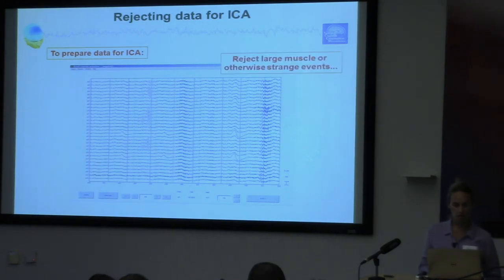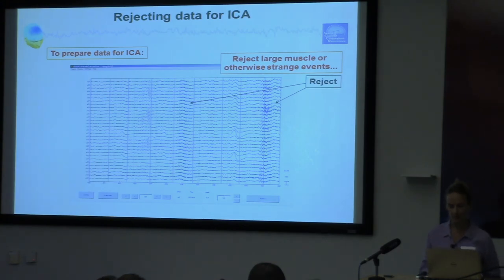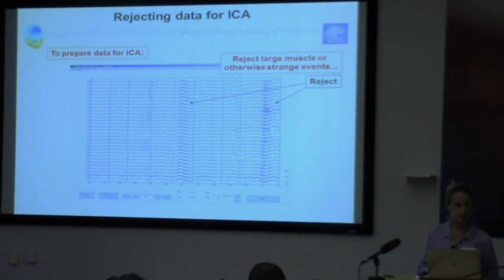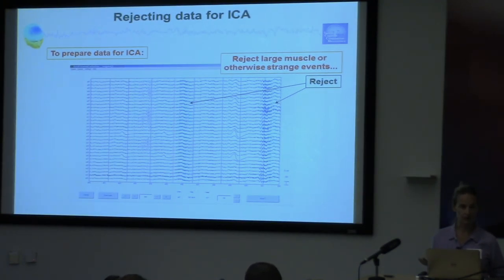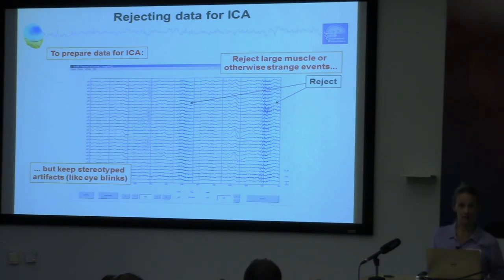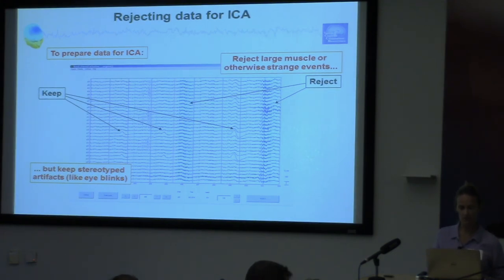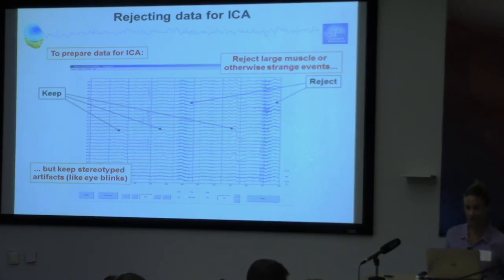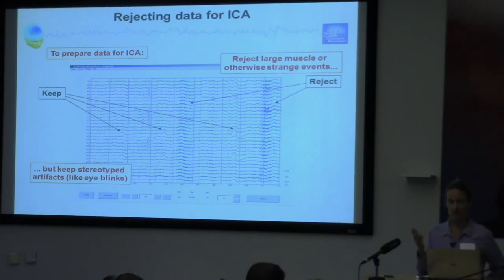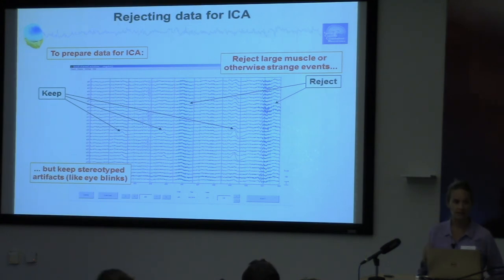Preparing for ICA: the general rule is that you want to reject large muscle or otherwise strange artifacts or events — things that are very large. However, you want to keep stereotyped artifacts like eye blinks, because ICA is very good at taking those out, and that's better than discarding perfectly good data. Even muscle artifacts are sometimes okay to keep. The large artifacts I rejected were ones going through all of the channels; if it's just your temporal electrode with a lot of muscle, ICA might be able to take that out.